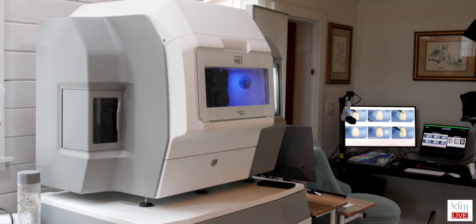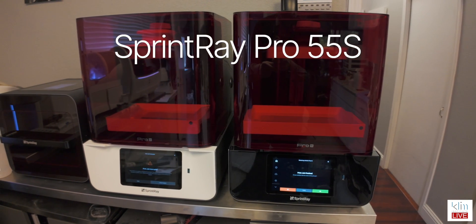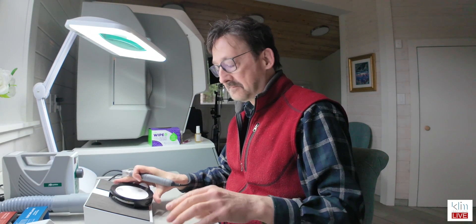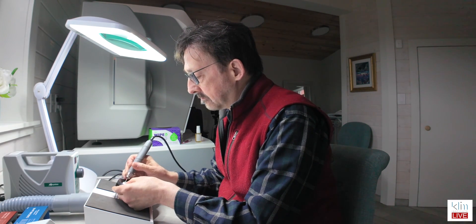Now up here at my home studio, I have the PM7, which is a five-axis and that can mill anywhere — and that's my preference. So in the future, what I'll be doing with a lot of my extra thin veneers is that I'll go ahead and print. I have the SprintRay 55S. I'll print the provisionals and place those, then I'll come up here and do my lab work in Idaho. This is my home setup, and then I'll take that back the next week and place them in.